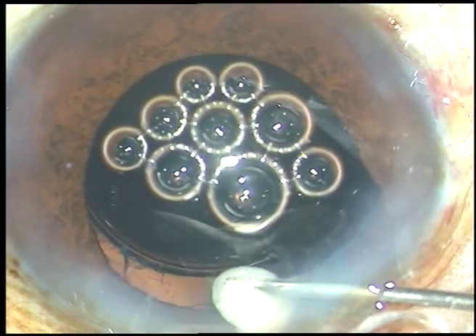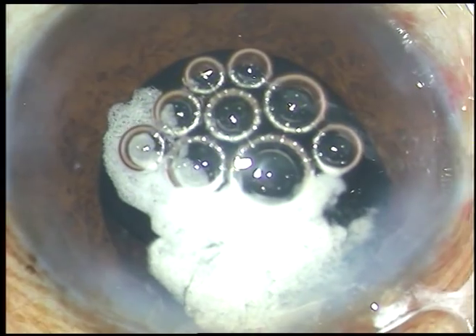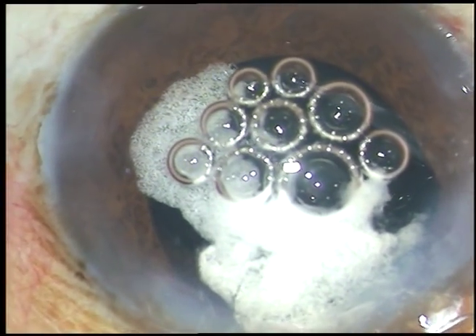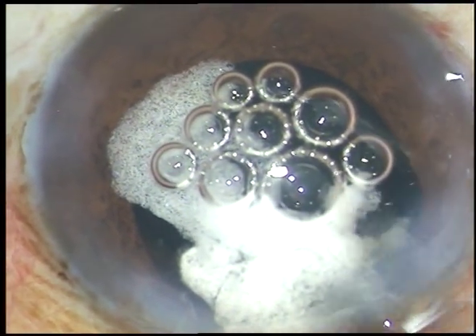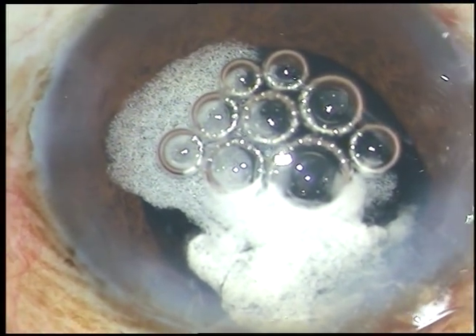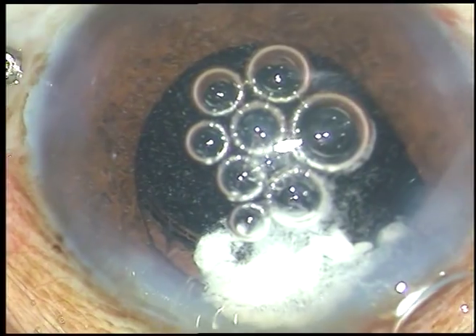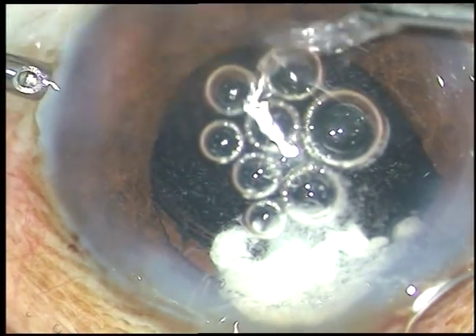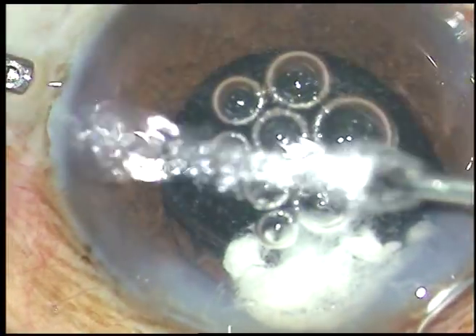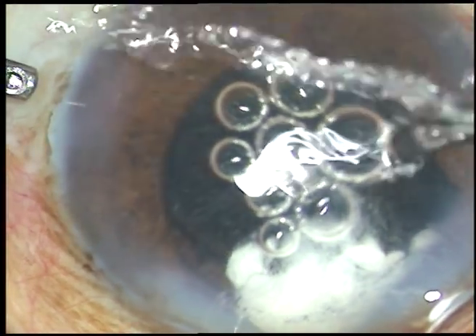Now I am injecting some more triamcinolone acetonide superiorly so that the vitreous strands get stained very well. Here goes the cutter — the irrigation aspiration. I am going to introduce the irrigation through the right side port at 8 o'clock and the cutter from the left side port at around 4 o'clock. The main incision is at 10:30 o'clock.